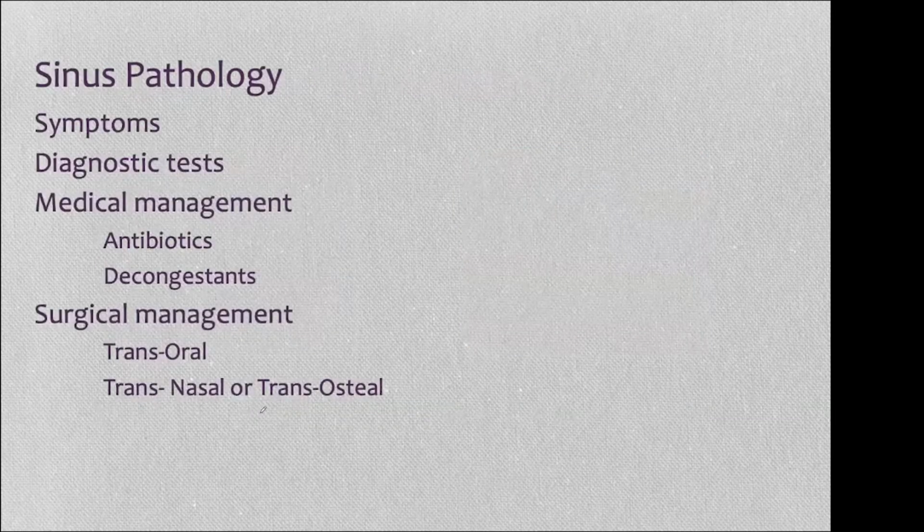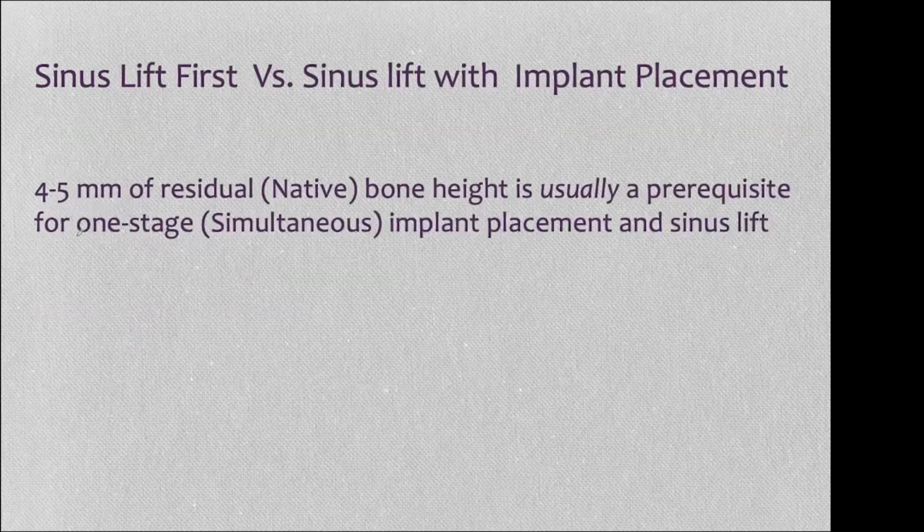So as you're selecting your cases, you are making that decision. What are you going to do? Now, what are your limitations? Basically, the cutoff is dependent on your experience, expertise, and level of comfort in the type of implant or length of implant you want to place. And I strongly urge you to use the ultra short implants. They work and they minimize your risk. And secondly, it depends on the native bone and the combination of the two.